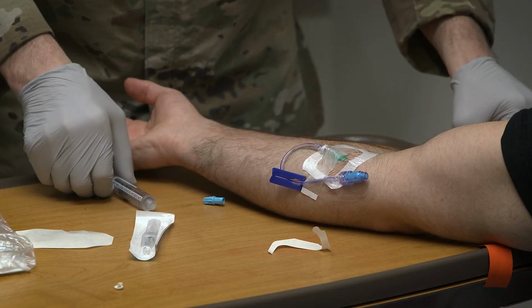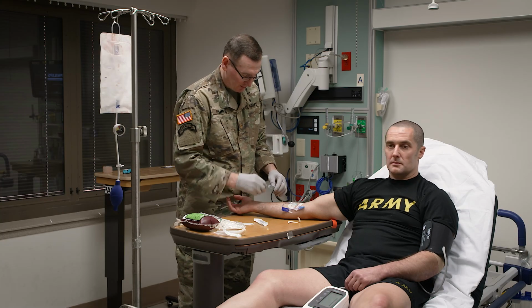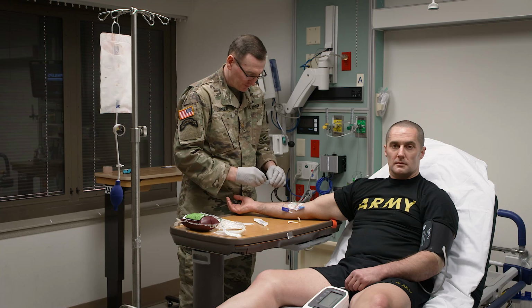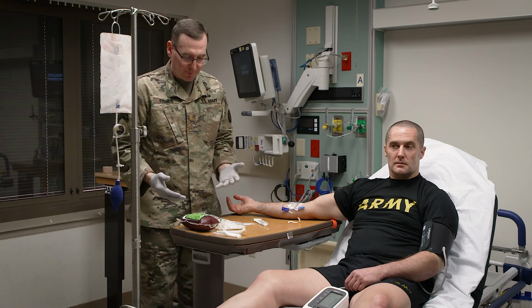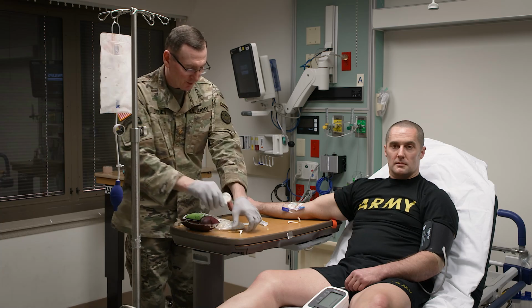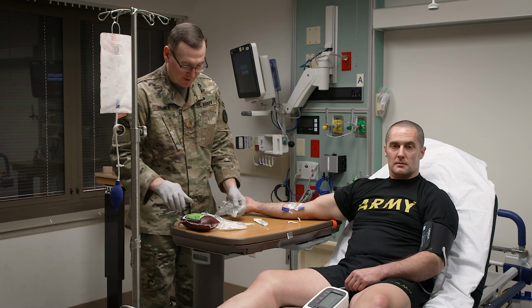Okay, make sure you move all sharps to the appropriate place so you do not cause any sort of injury to yourself or others. And next thing we're going to do is we're going to talk about how to prep your blood bag and all the appropriate measures to ensure that you're doing this safely.